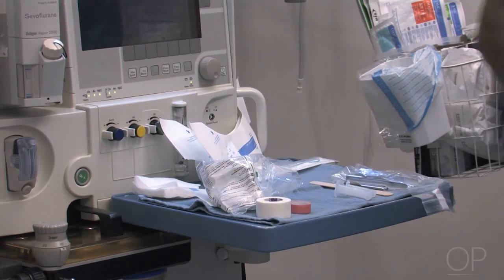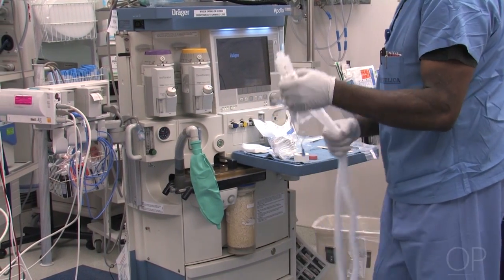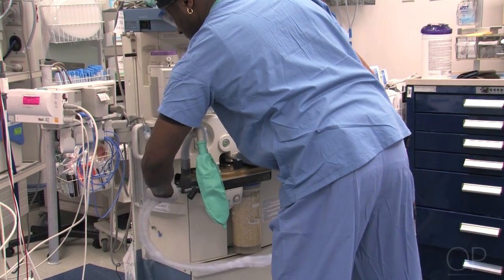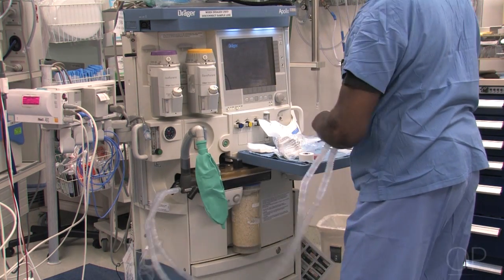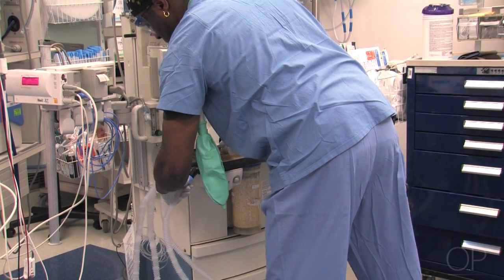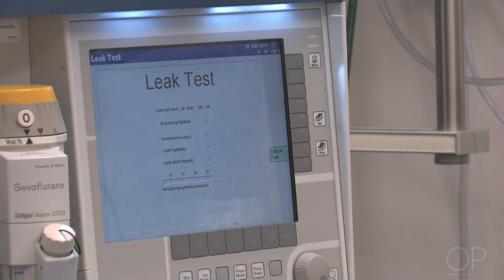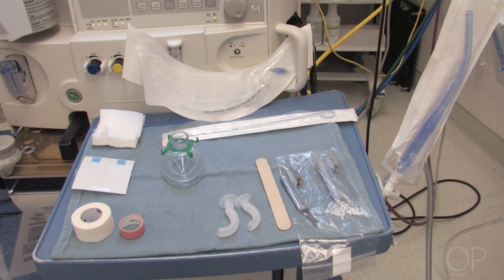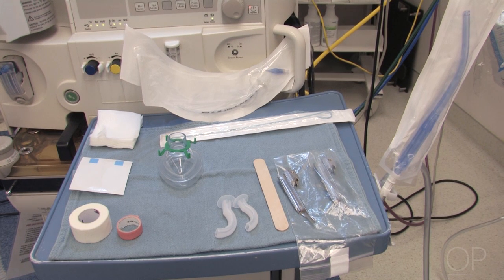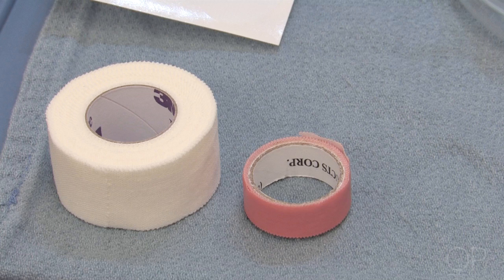The appropriate size ventilation mask is placed. A clean circuit is taken out of a bag and applied to the machine. A leak test is then performed on the anesthesia machine. While the leak test is being applied, you check your items to make sure that everything is the appropriate size and all items are out and accounted for — tape, eye guard.